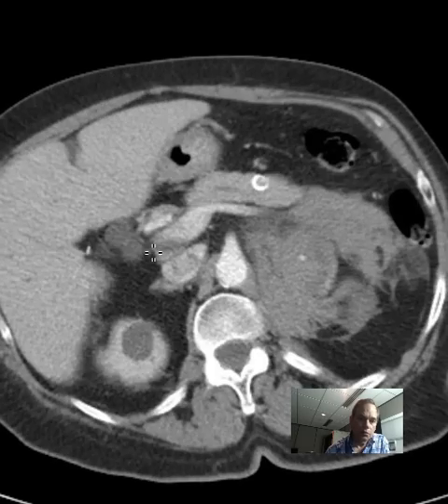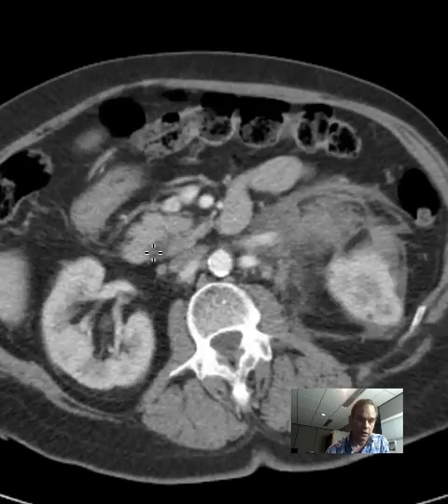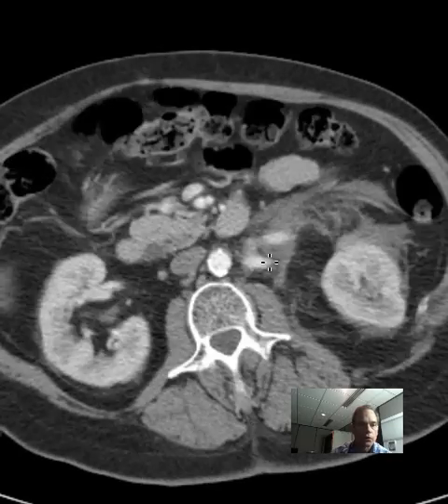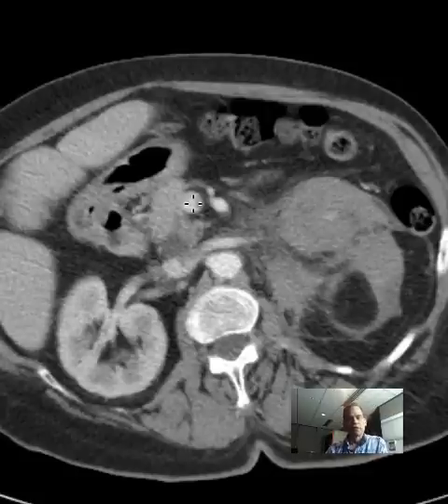That's one thing that goes to the liver. What else goes there? Well, the portal vein has to go there. Where is it coming from? From the mesentery and the bowel. So if we go out to the bowel here in the mesentery, and you see all this mess, and you don't know what to make of it because it just looks like all these lines and squiggles and stuff, go back upward to the root of the mesentery. Right here around the pancreatic head, you'll see the superior mesenteric artery and the superior mesenteric vein.